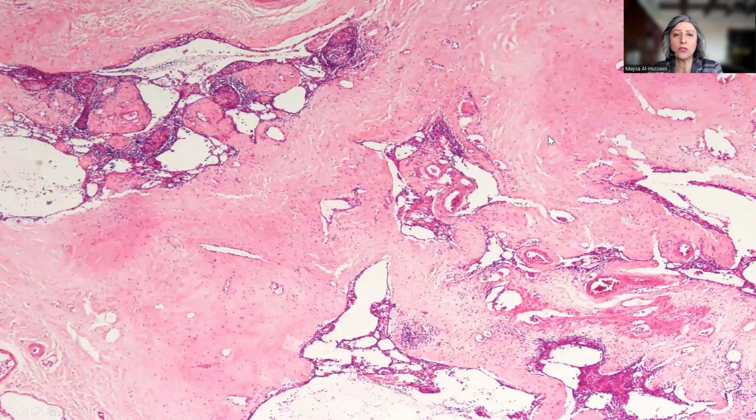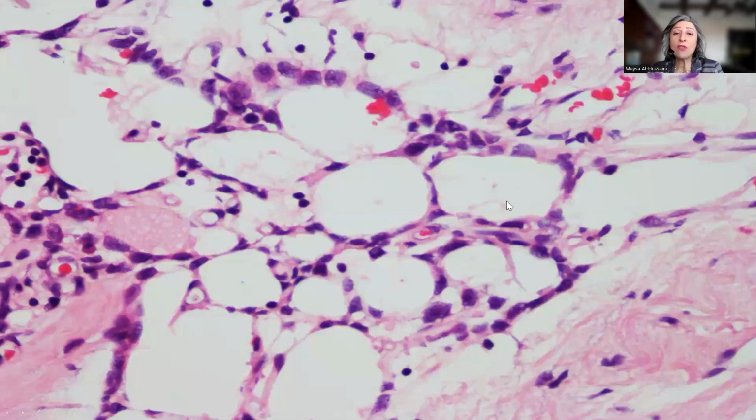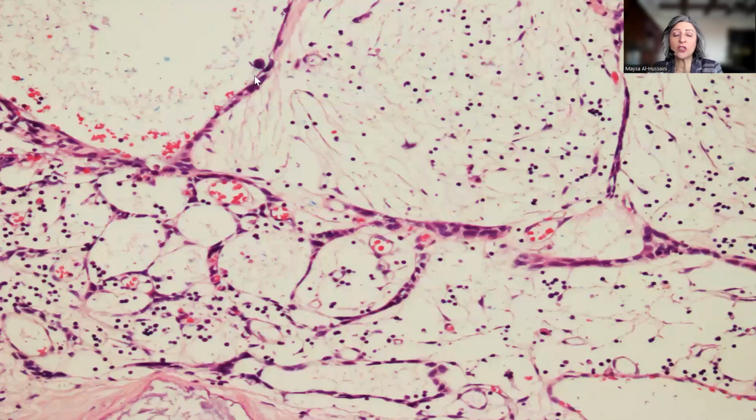And in general, those tumors tend to show a predominance of fibrosis/sclerosis. Now, the fat component in this particular example was not very prominent. It was only focally present and surrounded by strands of the epithelial cells as well. And here again, some minor component of lipocytic differentiation. And in another focus, some edema and inflammatory cell infiltrate.